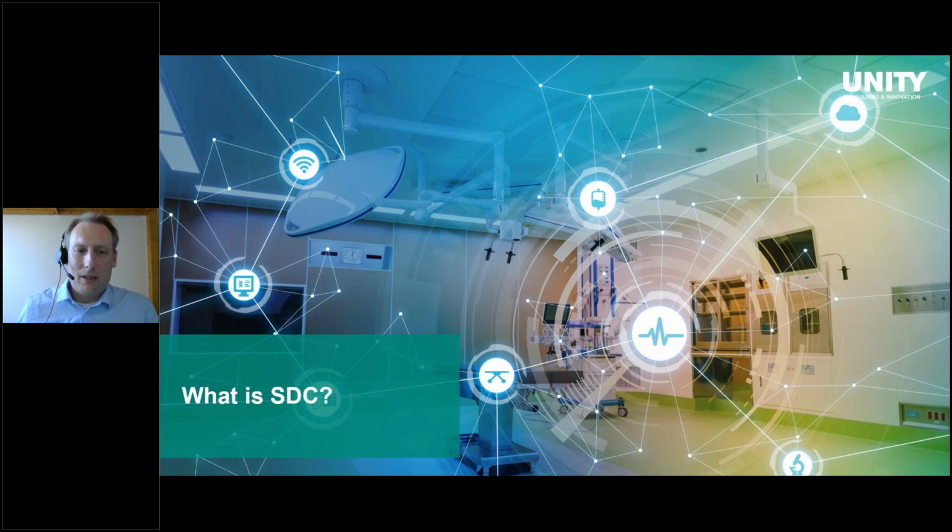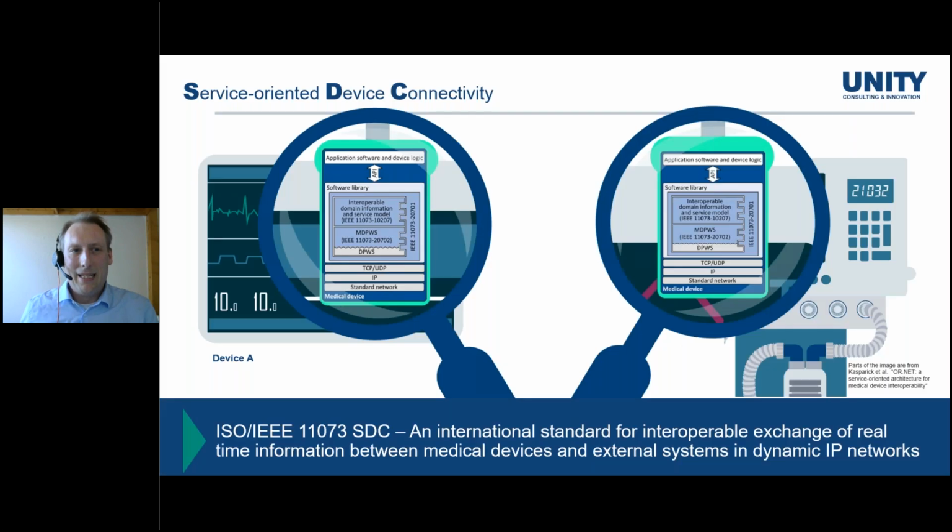So for those of you that have seen the results of the poll, SDC actually stands for Service-Oriented Device Connectivity. And there's a long and quite funny story behind it, how it came to that acronym. But in order to get to know that story, I would ask you, please join the IEEE working group. This is where these funny acronyms come from. So standardization often sounds pretty boring, but actually we have a lot of fun there.